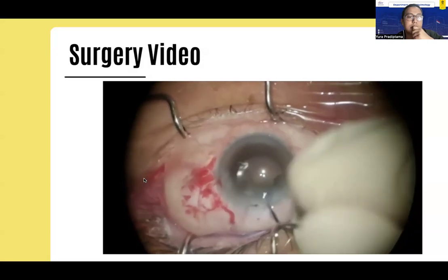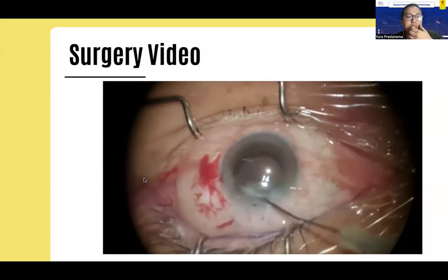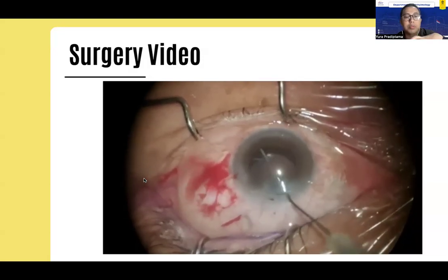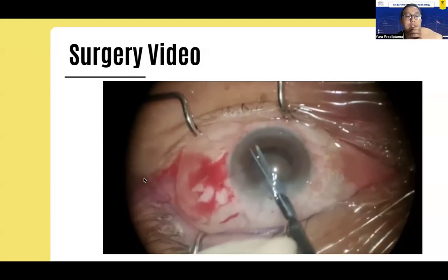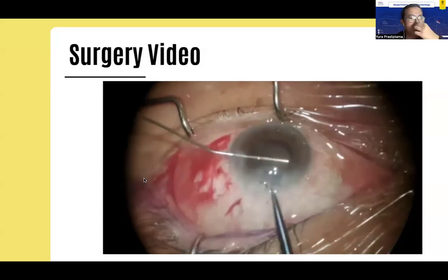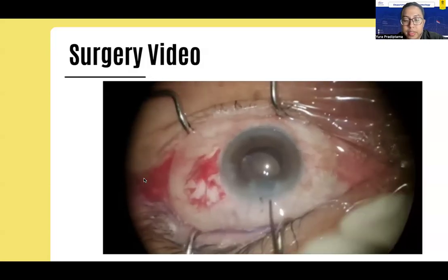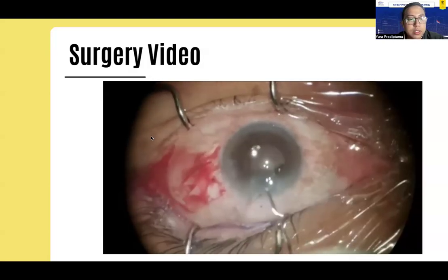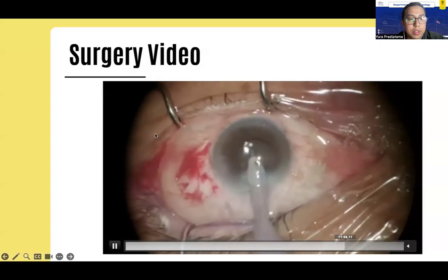Because from intraoperative, we see that the zonulolysis is too severe and the movement is not stabilized. So it is decided to do a partial Yamane, and there is some manual anterior vitrectomy. As you can see, the lens is in a central position.